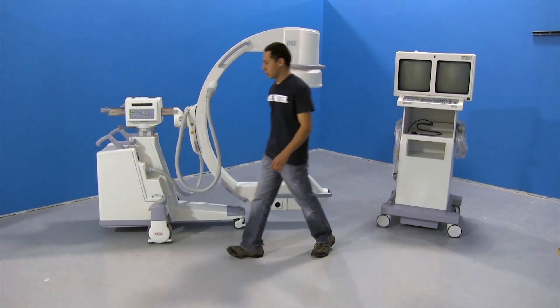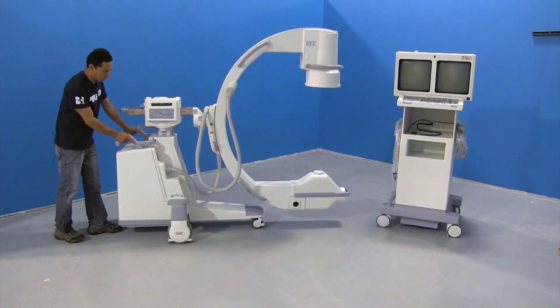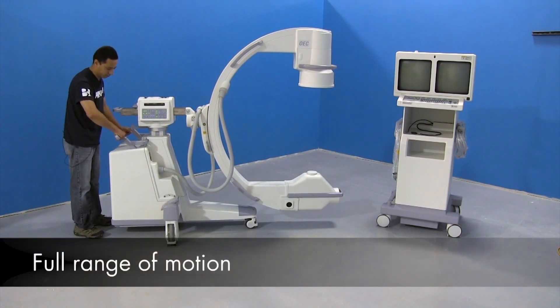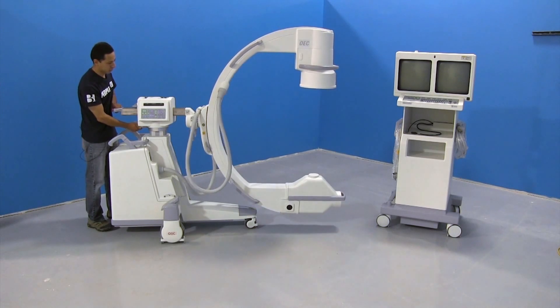Then we can move over to the C-arm. You have your foot brake, which hopefully you have already used. You have your steering — you want to make sure you have full range of motion. We'll go to the wigwag: you release it and make sure it has full range of motion.